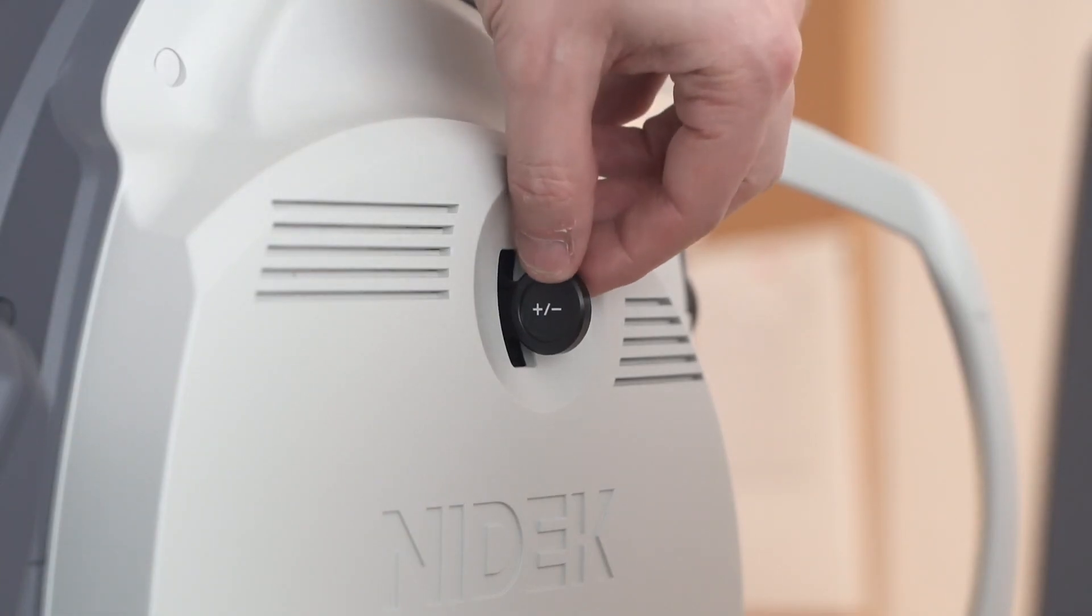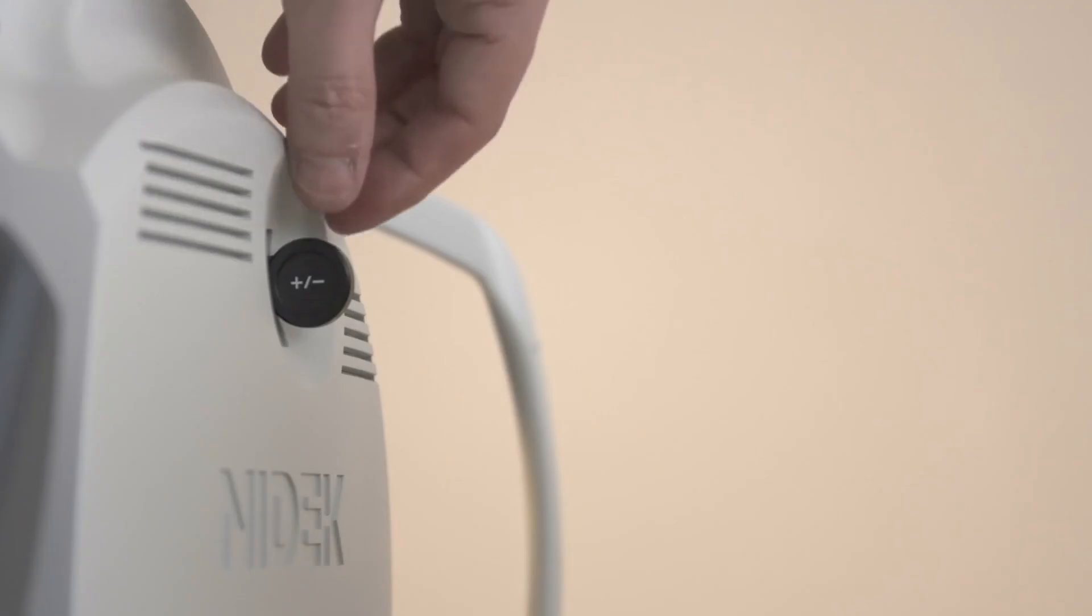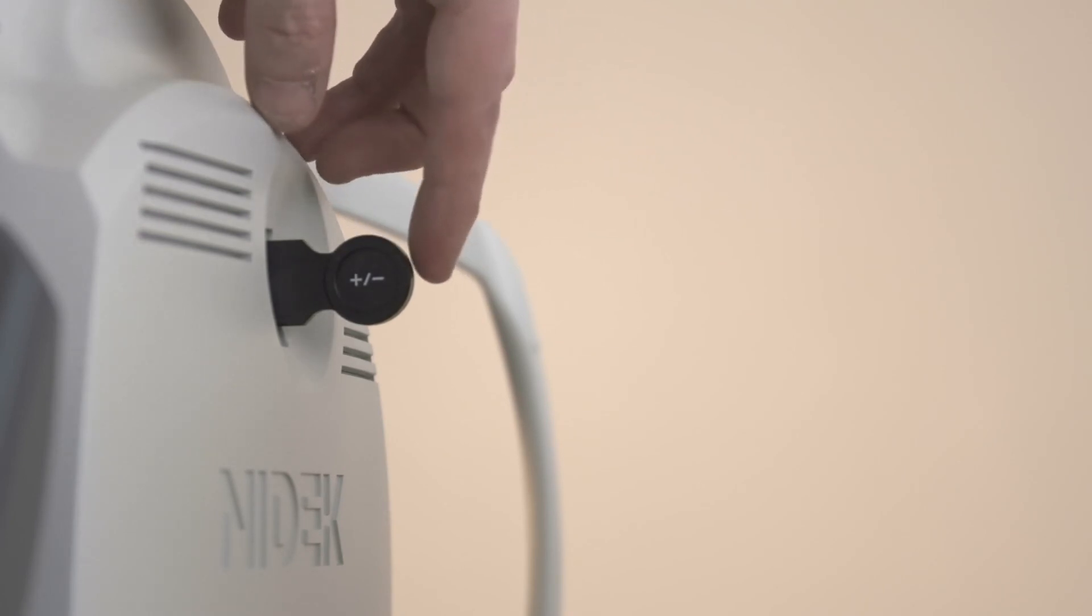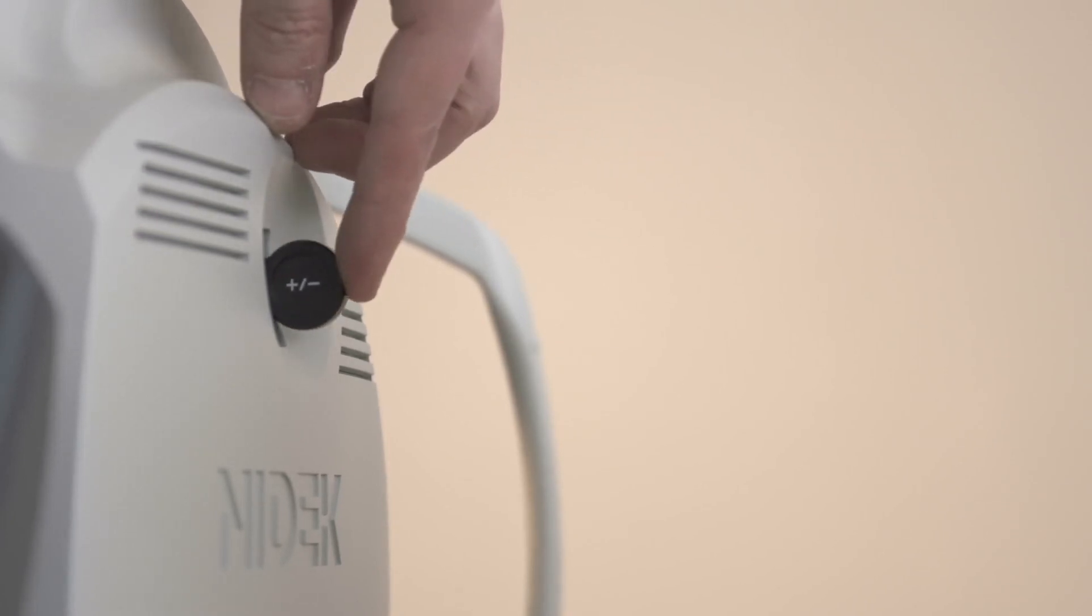On the side of the device here is a paddle which is used to increase the focusing range of the AFC330. Pulling it out once increases the negative focusing range. Pulling it out again increases the positive focusing range. Normally the paddle would be pushed fully in.